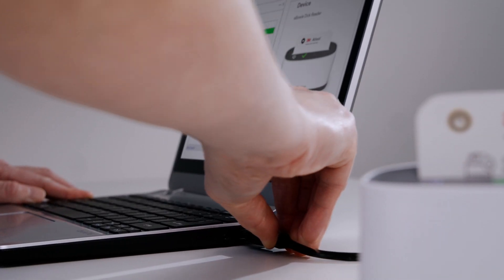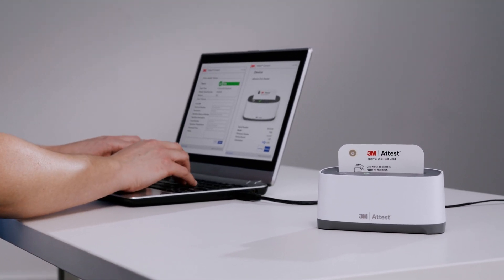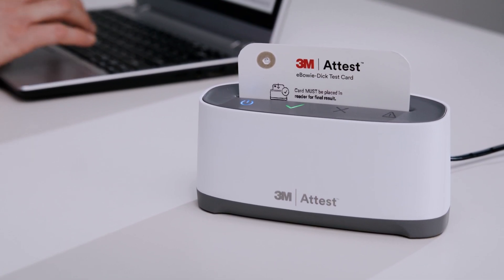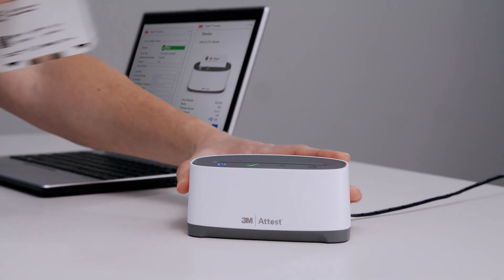A green check for a processed test card indicates a passing result. After the eBowieDIC test is complete, your results can be automatically stored on your PC using the 3M ATest Connect PC application that comes with the system. Or, alternatively, test results can be recorded manually. After the result has been recorded, processed test cards may be discarded according to your facility policy.